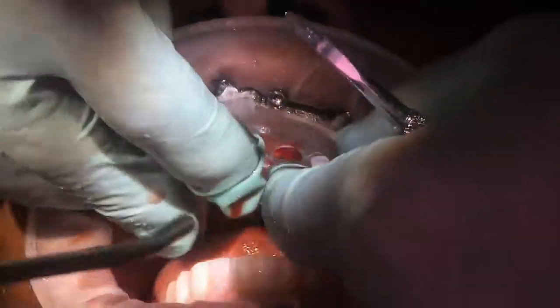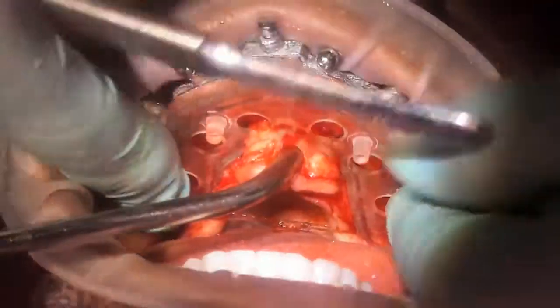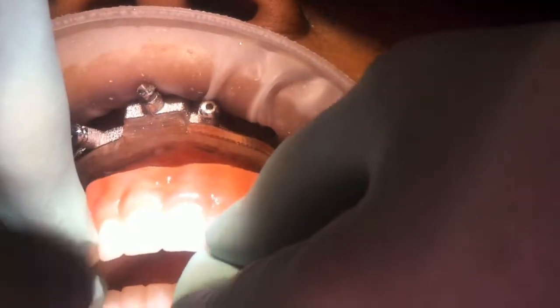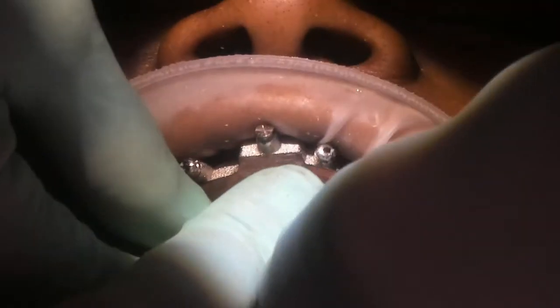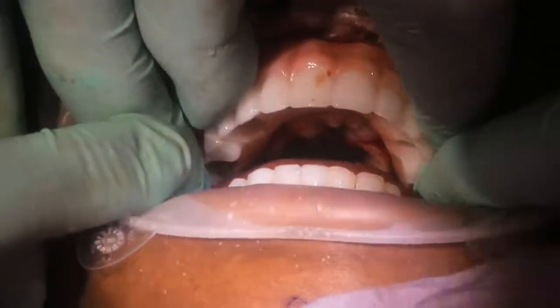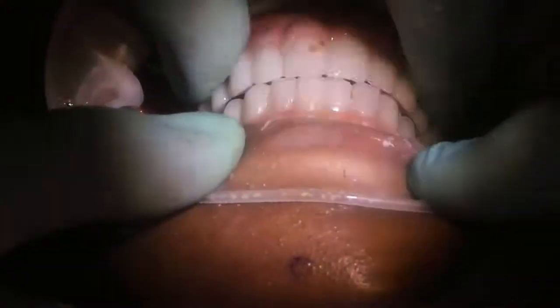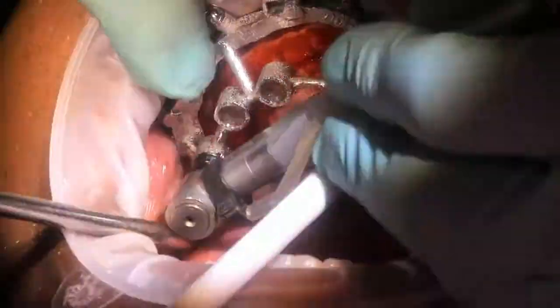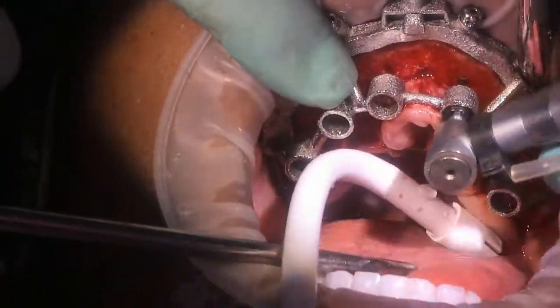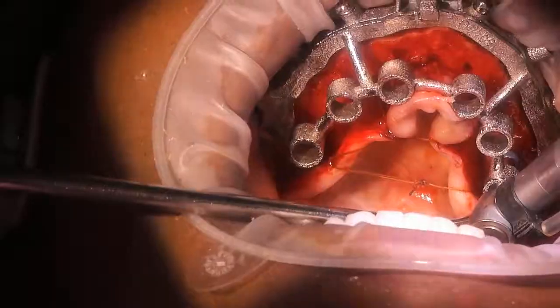A helpful trick that most chrome users use is to place the carrier guide and make sure that it seats and clips in gingerly. If it does, then you can place the prosthetic and check occlusion in a single arch case. In a double arch case, you can't really check occlusion because the opposing arch will have new teeth. In this case, they happen to just come together. Then the osteotomy guide is seated and all the sites are drilled as per normal chrome protocol.